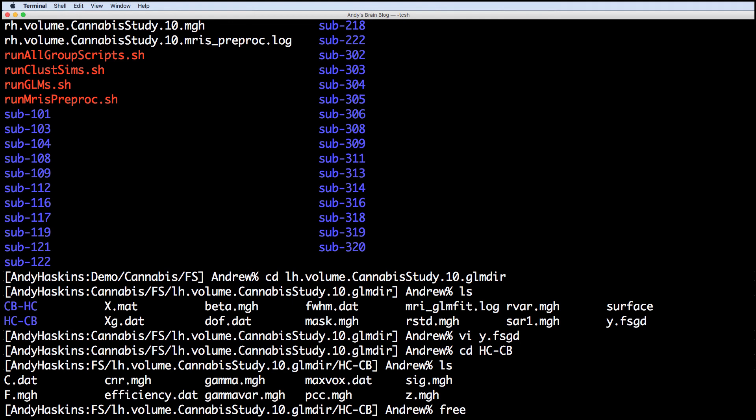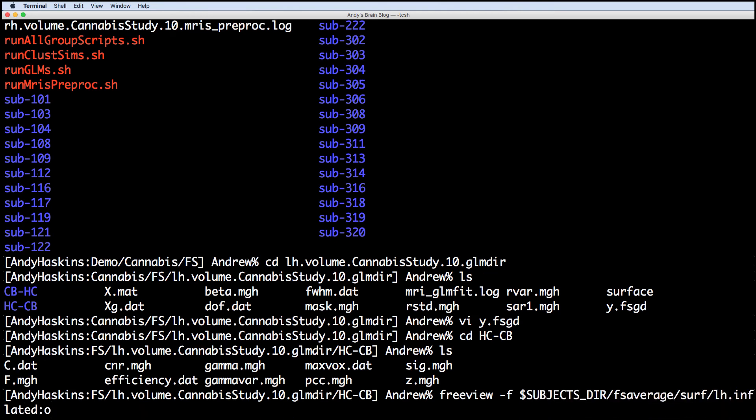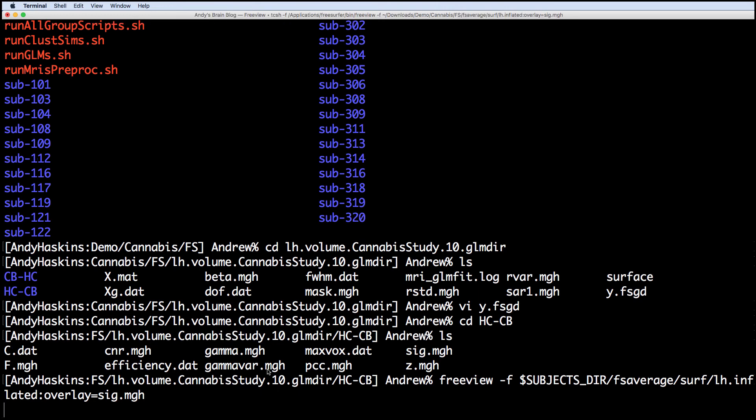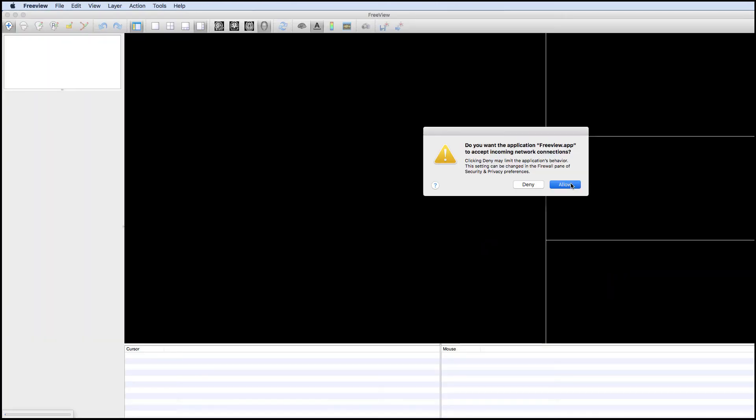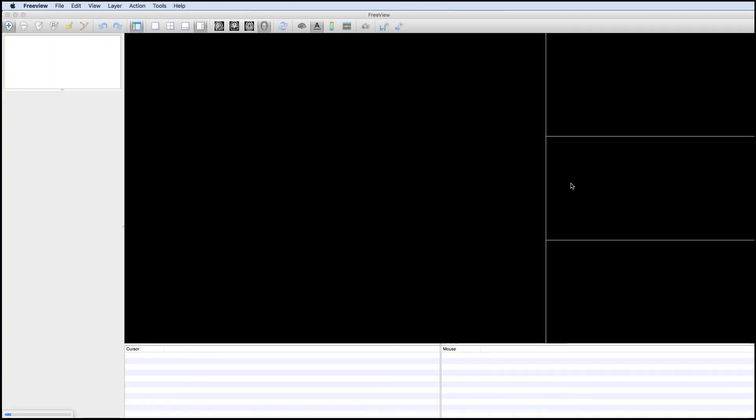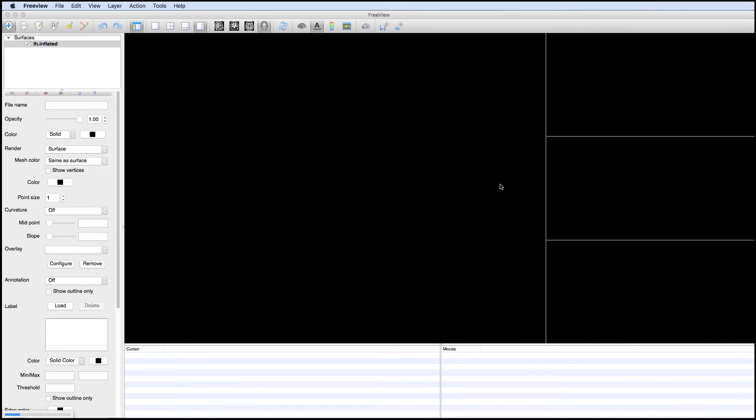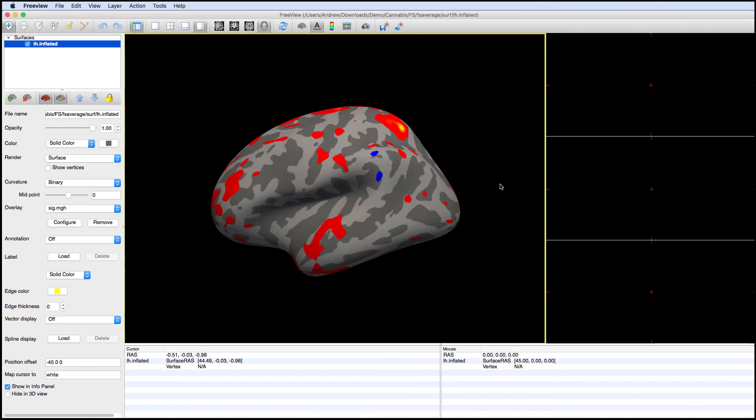We can see the significance maps on the FS average overlay by typing the following: freeview-f, subjectsdir, fsaverage, surf, lhinflated, and then a colon to specify the overlay. This overlays the sig.mgh file on the FS average inflated template.